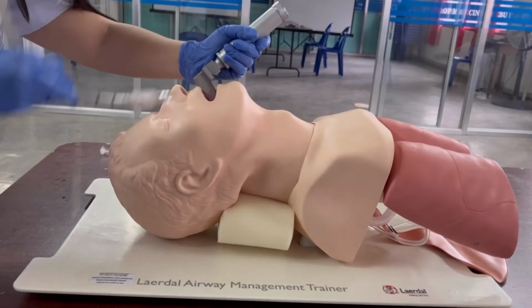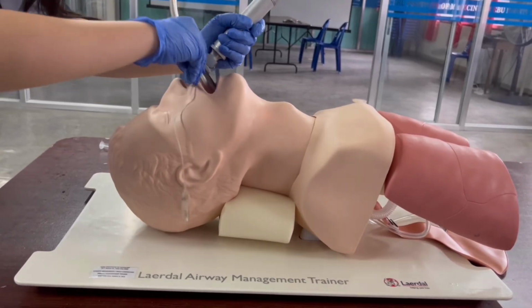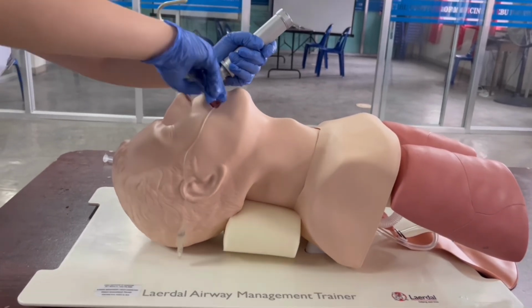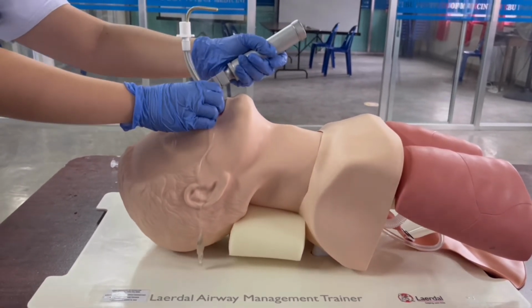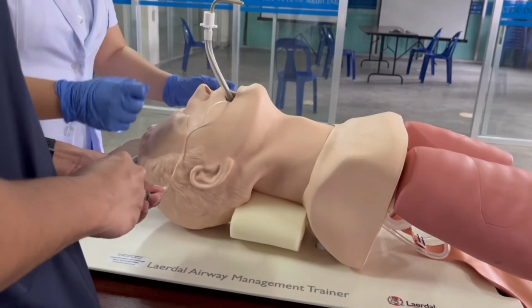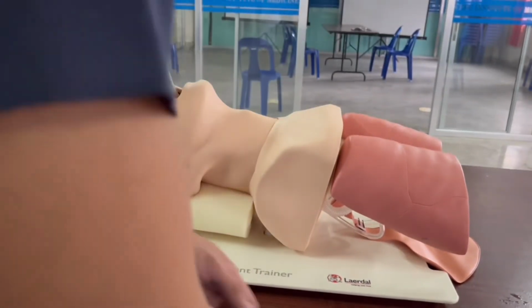The endotracheal tube is then passed at the right corner of the mouth. The tip of the tube is passed through the glottis opening and is advanced by 2 cm until properly placed. Carefully remove the laryngoscope. Inflate the cuff using the 10 cc syringe. Remove the stylet carefully while holding the endotracheal tube.